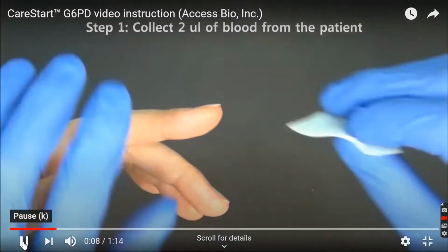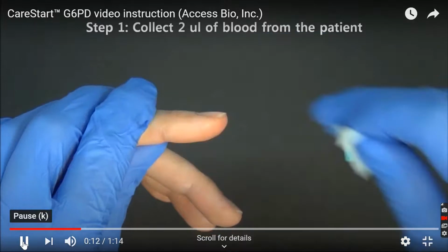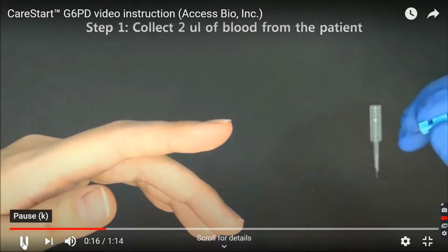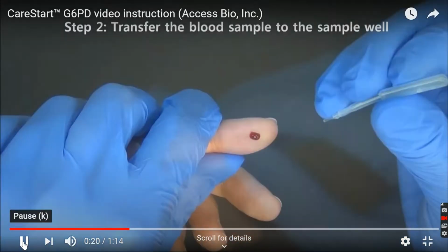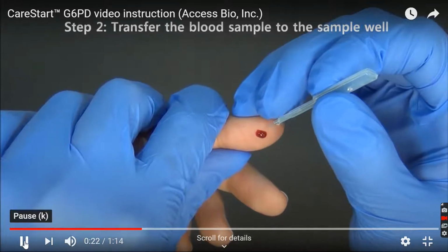You then need to collect capillary blood from your patient. That's a total of 2 microliters. You can do so with a pipette that is included in the test kit. This pipette has a line which you can roughly see here that indicates once you've collected 2 microliters of blood. The test is fairly sensitive to volume, so ideally you should make sure that the volumes that you use are correct.